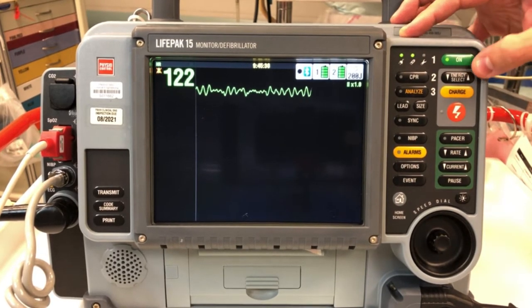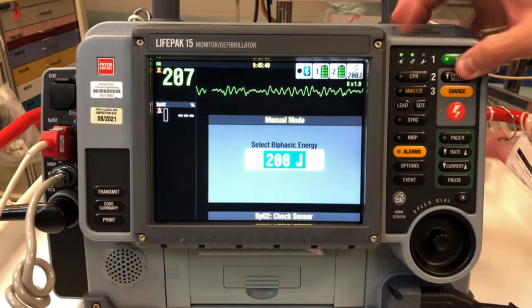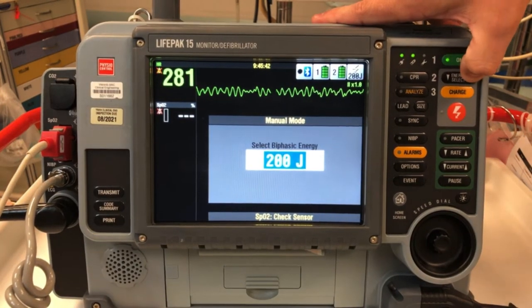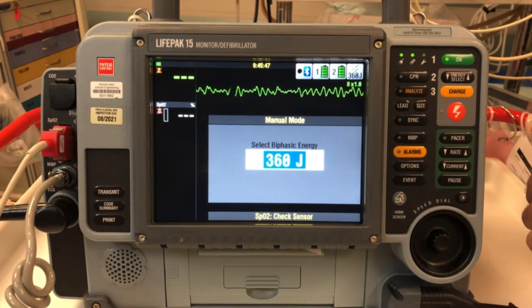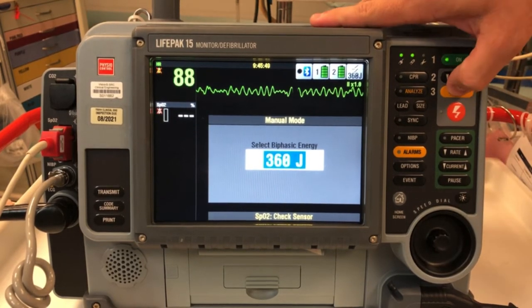All of your defibrillator options are in gray. You will select your energy by either the up and down buttons under the on button, or you can quickly increase by using the wheel, turning it clockwise. You will then charge.